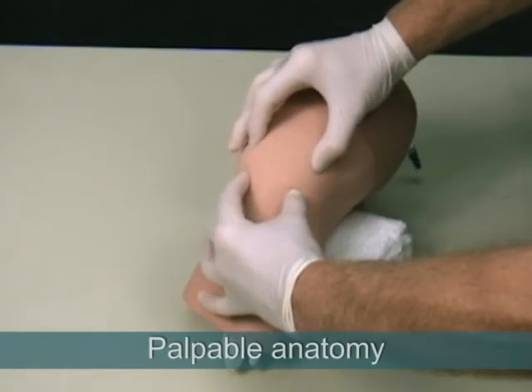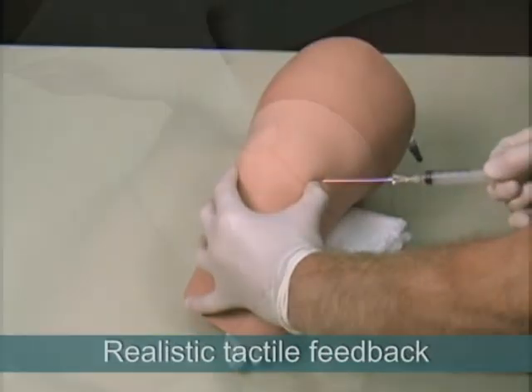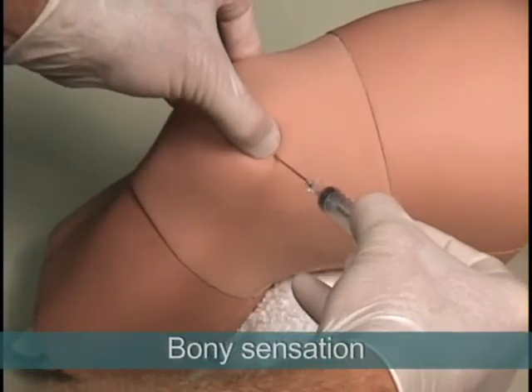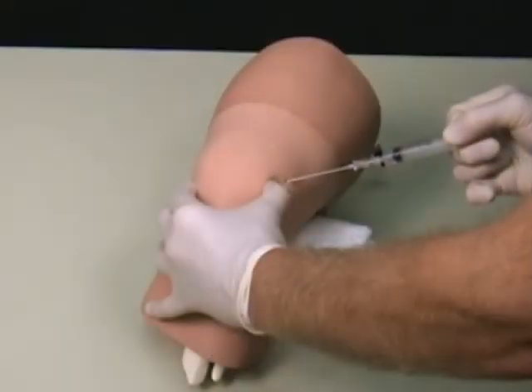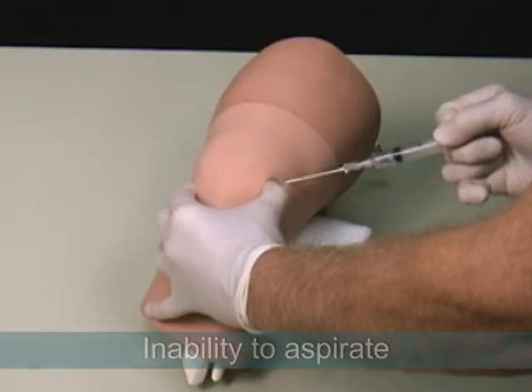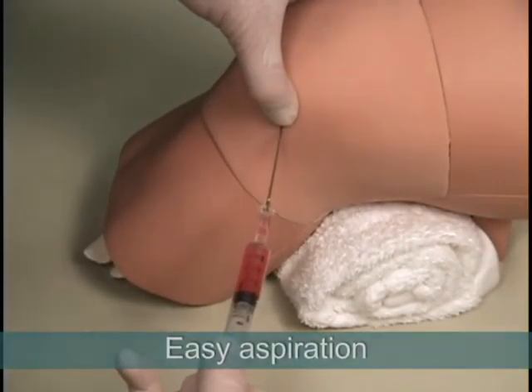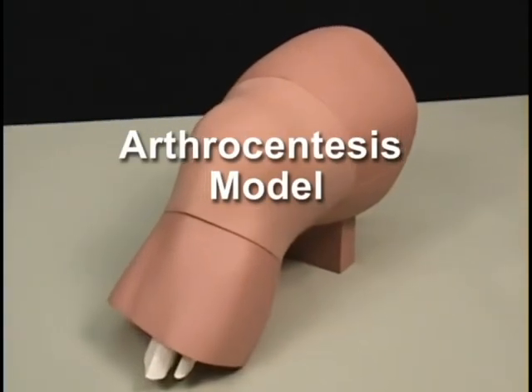During the procedure, the anatomy is palpable and the model provides a realistic needle response. The tactile feedback includes sensation of bony contact if the needle hits the patella or the femur, inability to aspirate the syringe while the needle tip is in the soft tissue superficial to the joint capsule, and easy aspiration of joint fluid when entry has been achieved. Thank you for your interest in the arthrocentesis model.